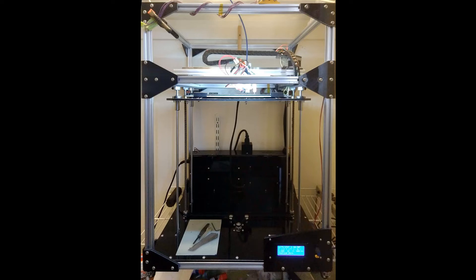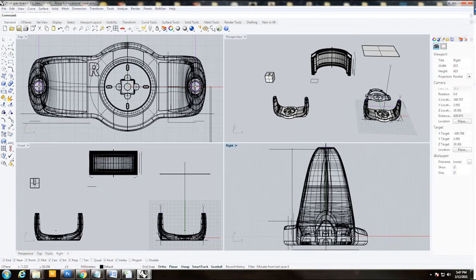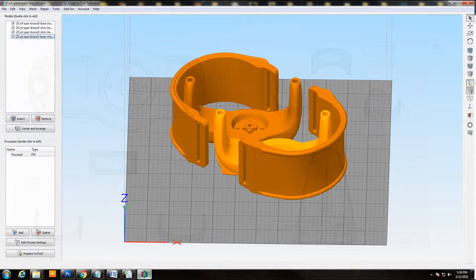This is the printer we built. We started by modeling the ankle-foot orthotic in a 3D modeling package and took those models and placed them into a program called slicing software, which generated a code that was then uploaded to the printer itself and run.